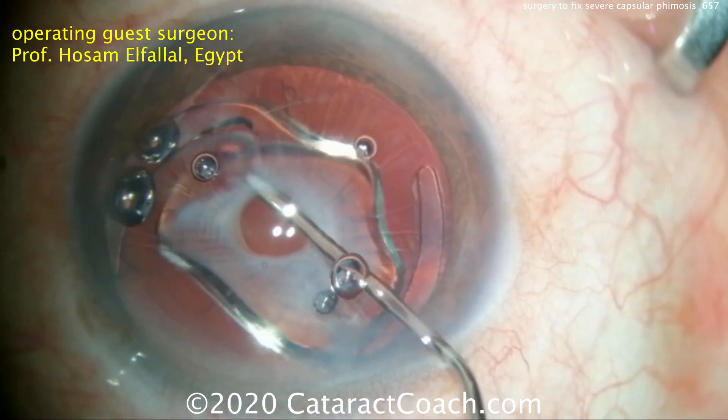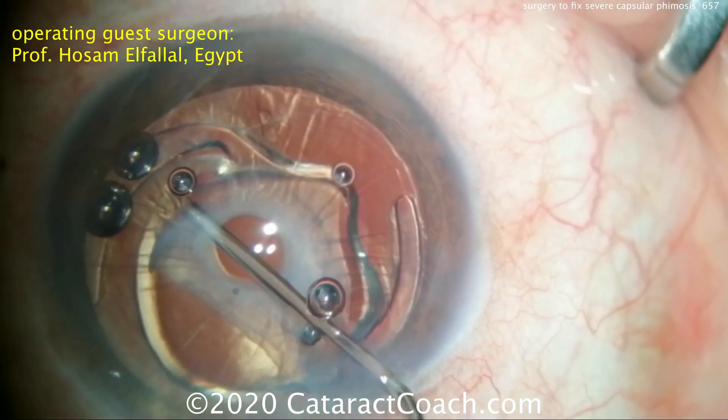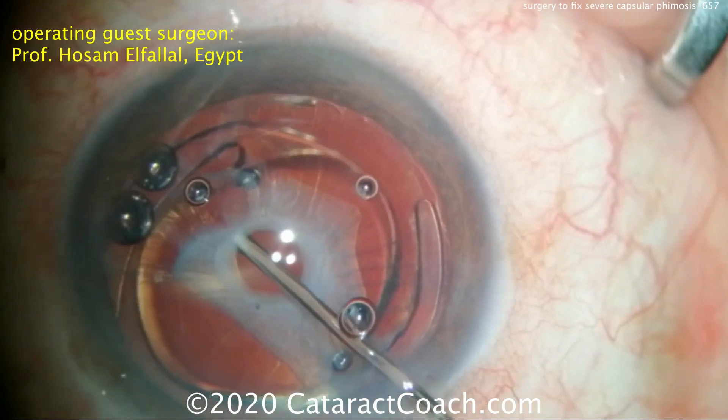It probably started off as about a 4.5 or 5mm capsular rhexis. Now look how flat the IOL is at this point. After injecting that OVD and making more space in the capsular bag, the IOL now resumes its normal configuration.